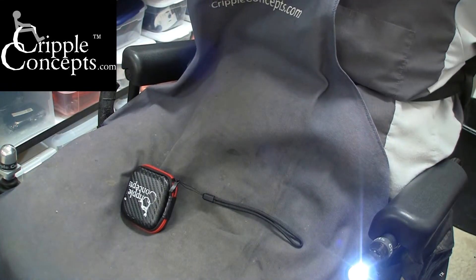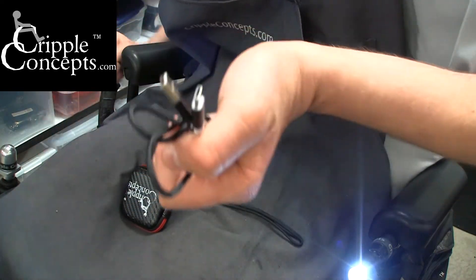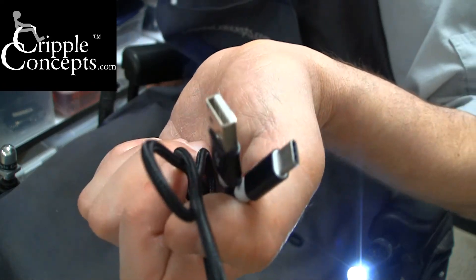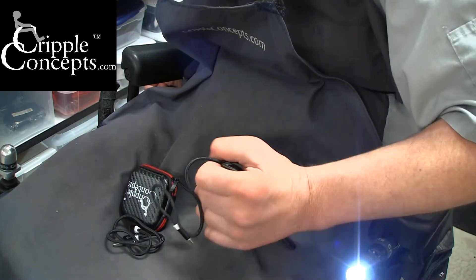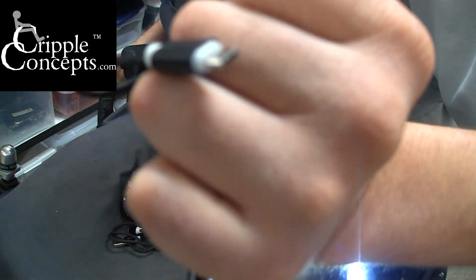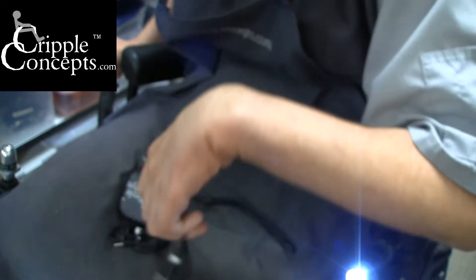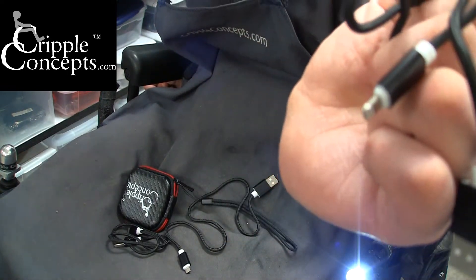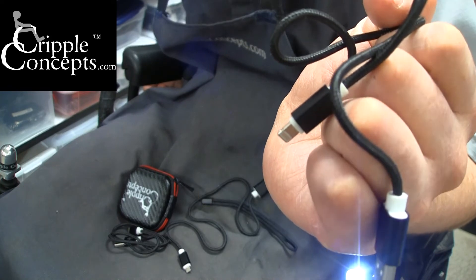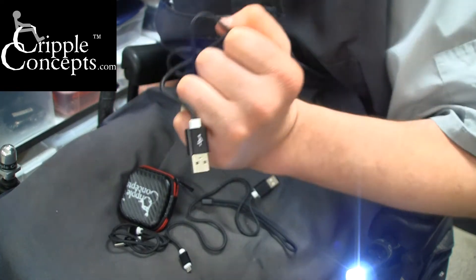The kit also includes your choice of charge cables. There's USB Type-C, which is a small oval connector — USB-A on one side, USB-C on the other. There's also a Micro USB, which is used on a lot of older Android devices. Or an Apple Lightning, which is the flat Apple connector used on a lot of iPhones — up to iPhone 6 or 7. These cables are 18 inches long, and the Lightning cable is also offered in a 39-inch version.